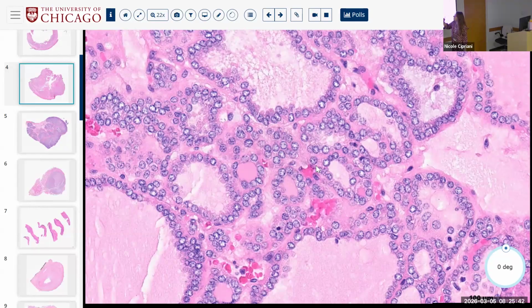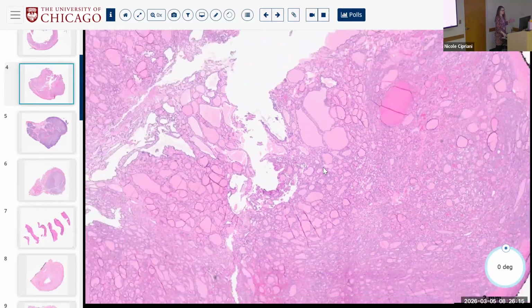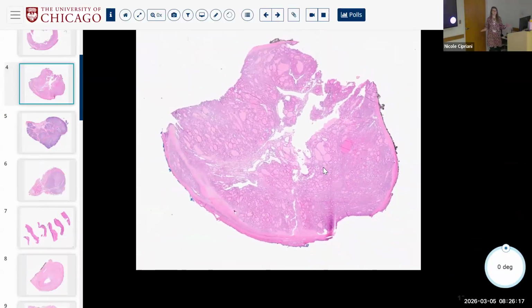The other thing I want you to take note about follicular pattern neoplasms, which we don't always talk about, but we do in cyto, is the cytoplasm. The cytoplasm of non-PTCs tends to be not so thick, not so dense, more sort of wispy and grainy or amphophilic, rather than this thick, dense cytoplasm of PTC, which we'll see, right? So always take into account the nuclei, how robust are the features, always take into account the cytoplasm, and always take into account the low power picture of this thing. Comments, questions?